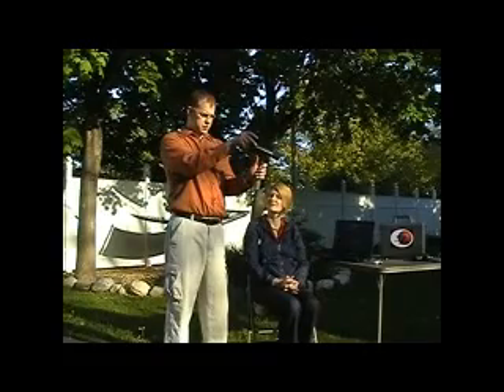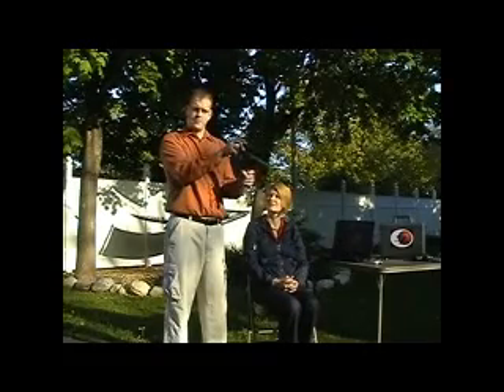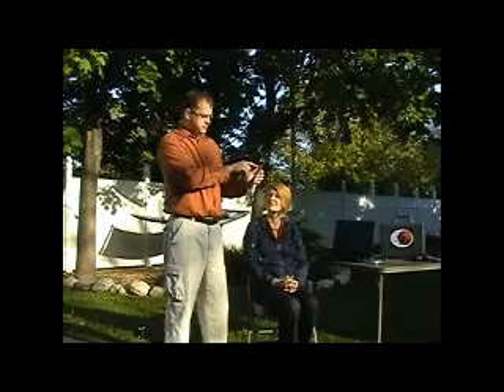To take retinal photos, you will want to hold ProVision's camera setup very similarly to what you had done before. This time you are going to slide the tumbler all the way down into Minus. You will leave the filter on the green for a non-dilated pupil. If you will be working with a dilated pupil, sliding that drum one click to the right offers you a bigger field of view. Set your illumination to about a quarter.